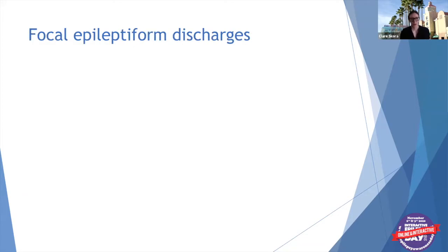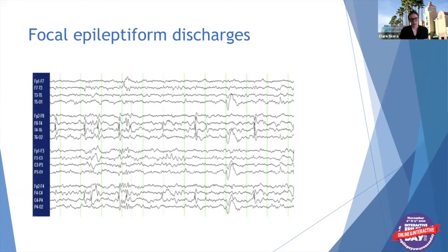And here's an example of focal epileptiform discharges that are just in specific areas. So here's an example, and you can think to yourself where they might be, but you look for, are there any interruptions in the background up here? No, not really, but you get down to here to the right. Now we're in the temporal and occipital, or temporal area really.